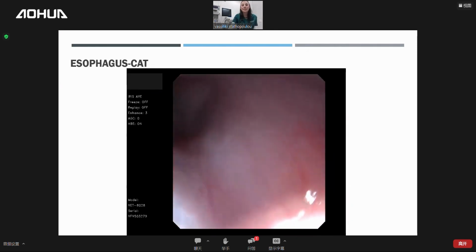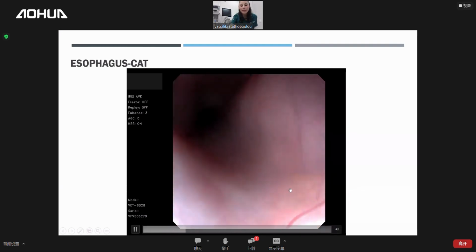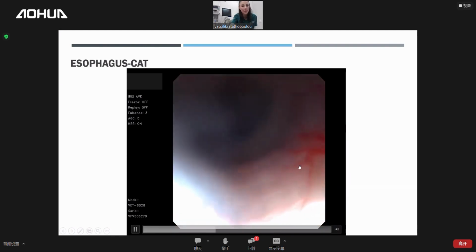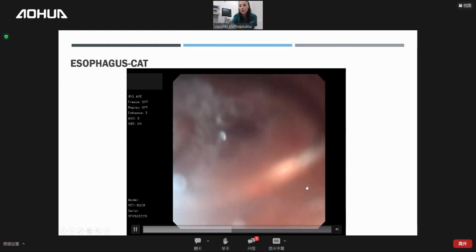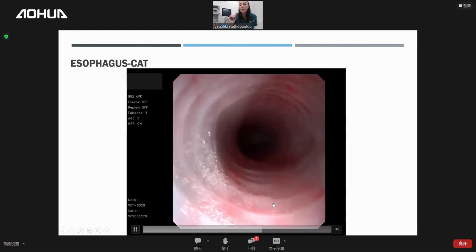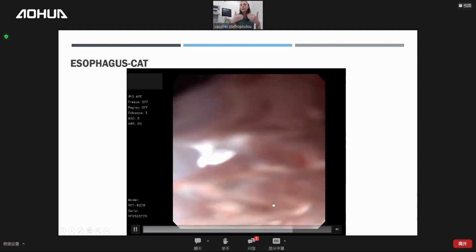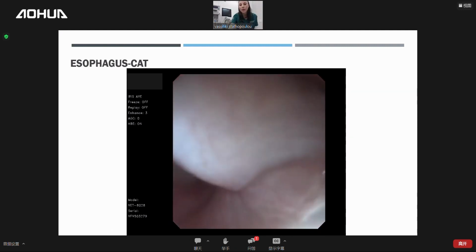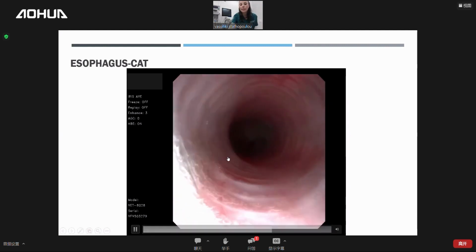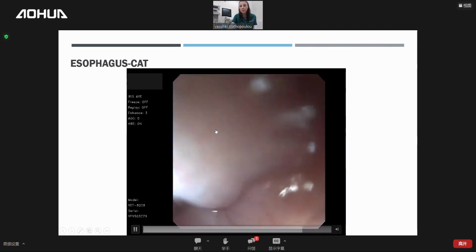Okay, and this is the esophagus of a cat. You see the vessels that are really, really prominent here in cats. You see how easily detectable they are in cats. In dogs, it's not the same thing. Can you see? These are the vessels of the esophagus. And these are the circular rings in the third distal part of the esophagus, just proximal to the lower esophageal sphincter. Okay, so in cats, if you see those rings, even if you don't know what this animal is, we don't write anywhere here what this animal is. This is a cat, okay?